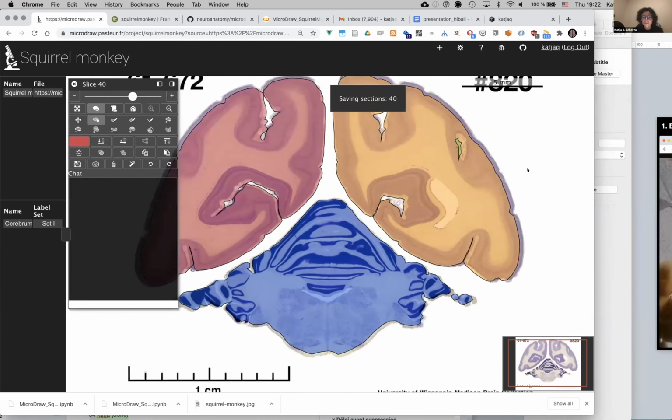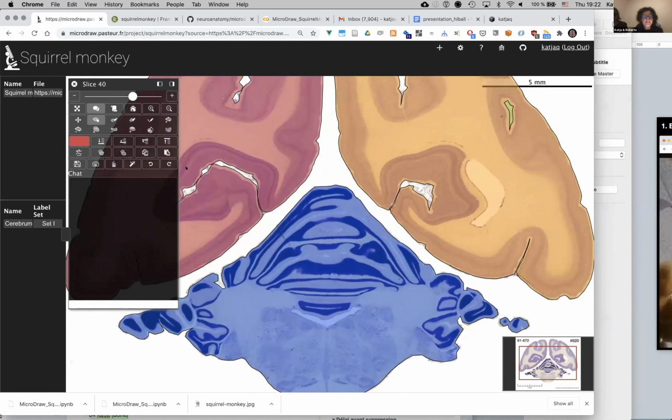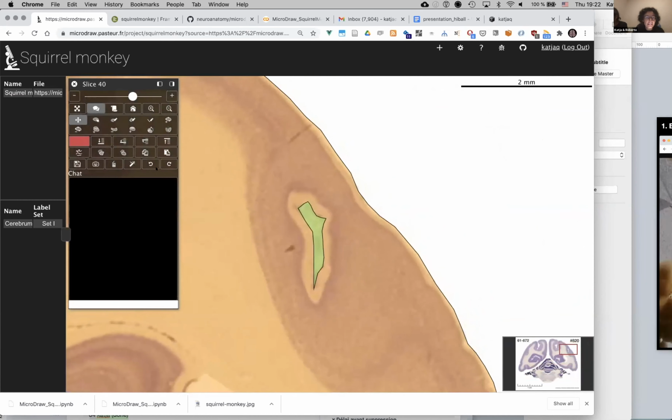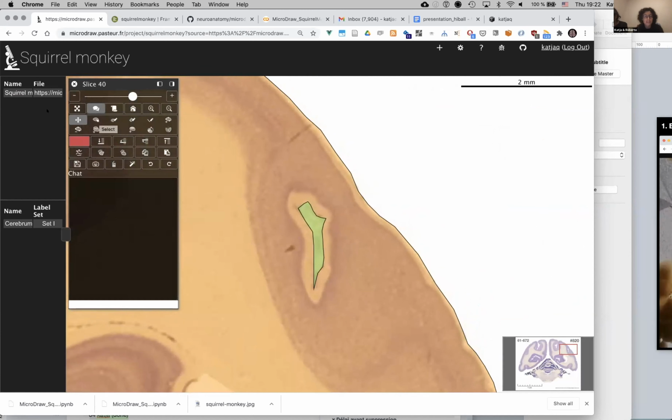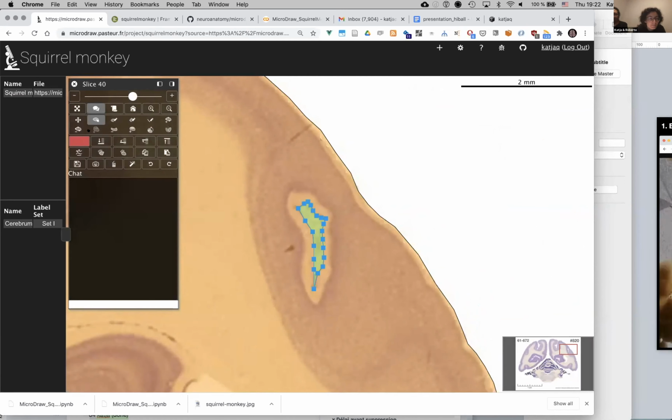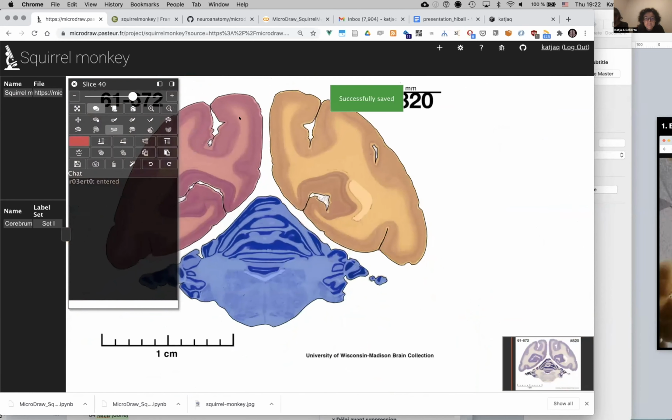Now you can see here that my little island, I put it green and I can go, does that work now? We fixed that, right? Yeah, the subtraction of the region? Yes. And now I have my little hole there.